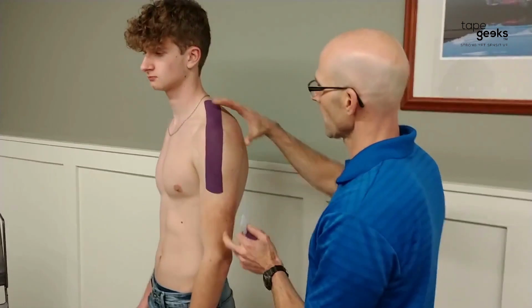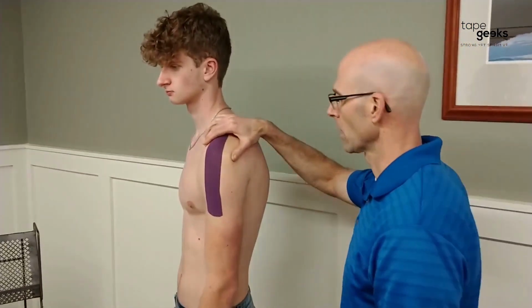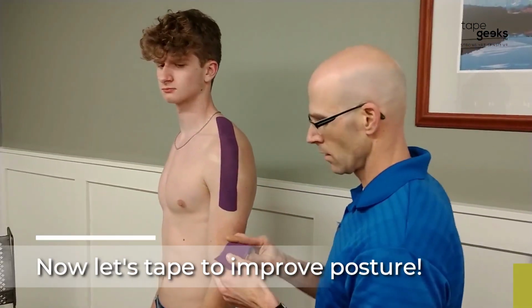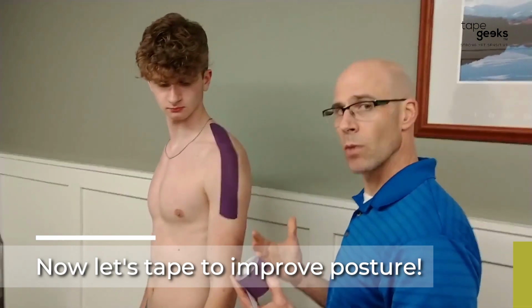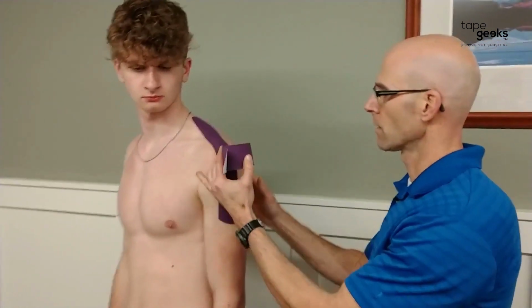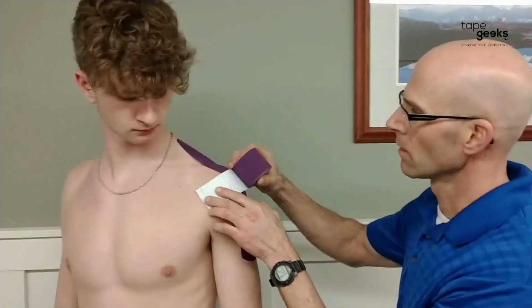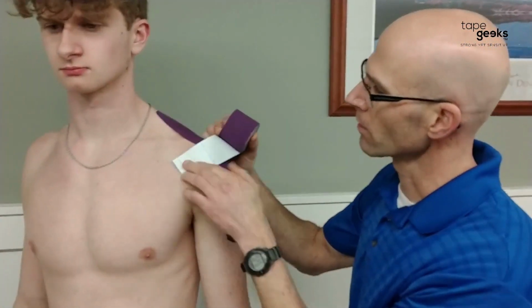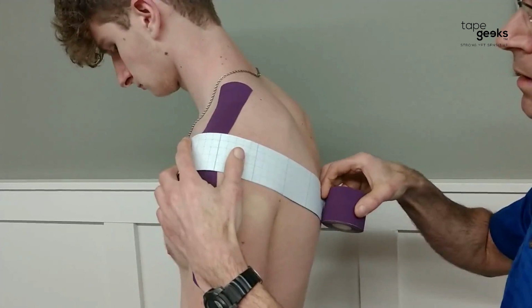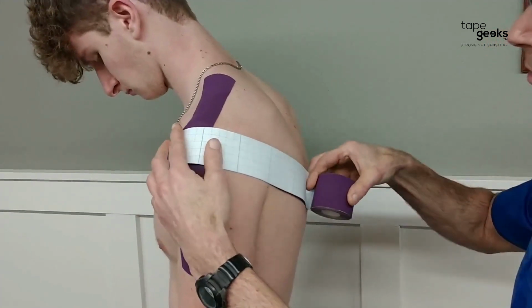Now another tape job to help with the posture component is, like I said, he's kind of rounded shoulder like most people get, and so we want to cue him to bring him back like this. Now this tape will not restrict motion. That's what I love about it, but it helps cue the brain to facilitate muscles to fire off to help improve their own action. All right, so we're going to measure again just from the front of the shoulder. We're going to bring it back to here, okay? We'll go back to the shoulder blade there.